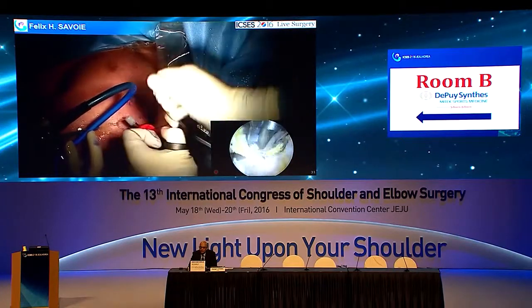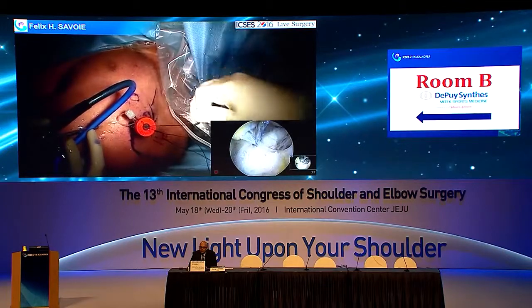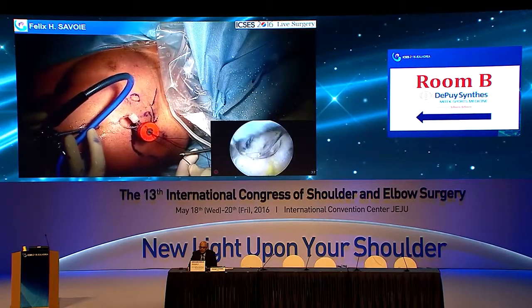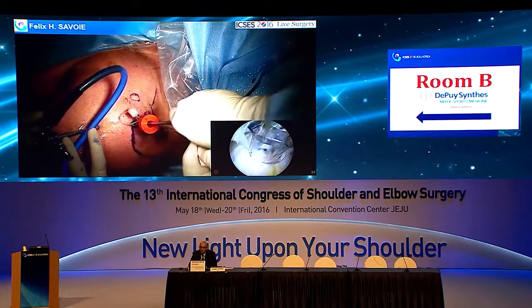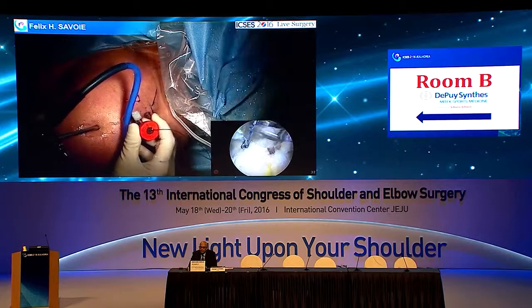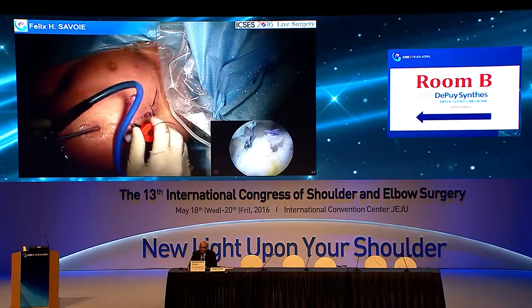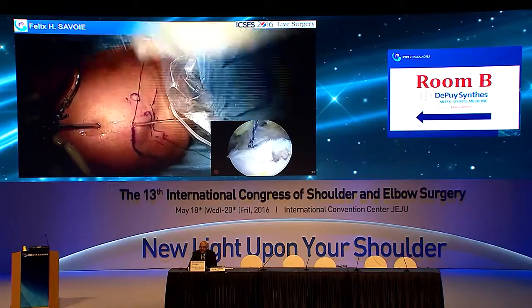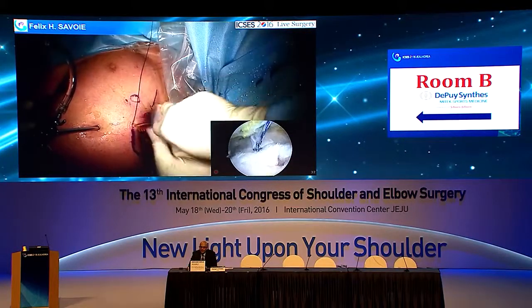And this is orthochord suture, so it's really nice. About half of it dissolves. Okay, so let's see. This goes like this. Oh, sweet. That's my first time to use that. So do you have the trocar, orange trocar for the knot pusher? Thank you. Crochet hook back.